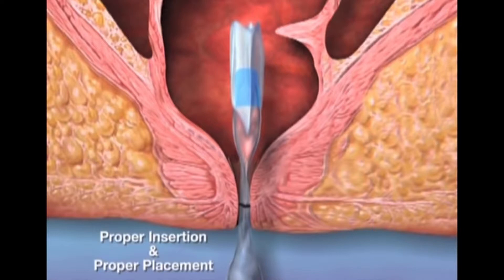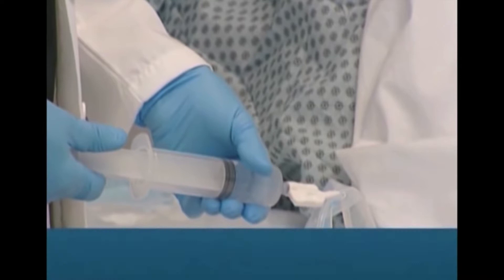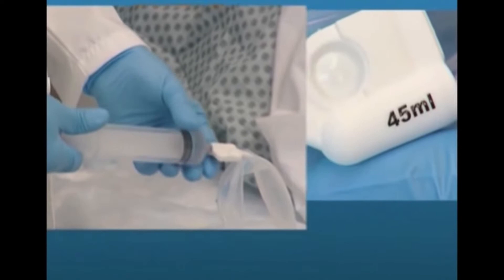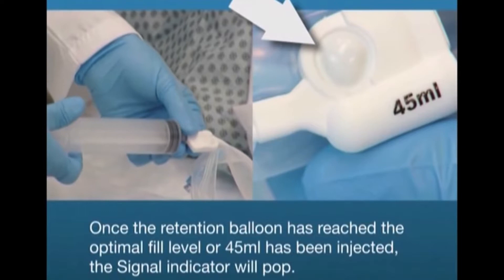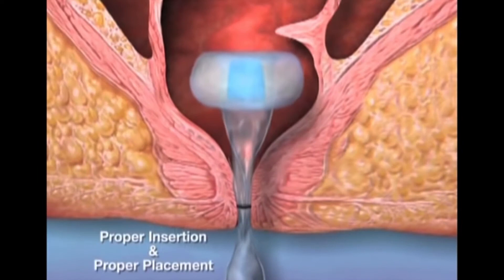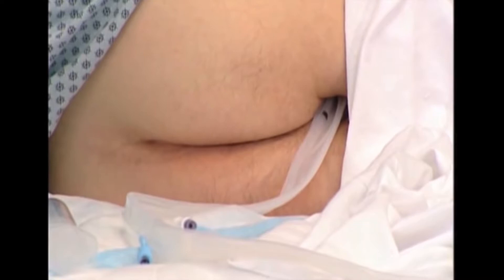Inflate the balloon with up to a maximum of 45 ml of tap water or saline by slowly depressing the syringe plunger. Under no circumstances should the balloon be inflated with more than 45 ml. While depressing the syringe, take note of the signal indicator. Once the retention balloon has reached the optimal fill level or 45 ml has been injected, the signal indicator will pop and will remain popped while the balloon is at its optimal level. Once the signal indicator pops, stop filling, detach the syringe from the inflation port, and gently tug on the catheter to ensure the balloon is properly positioned against the rectal floor.